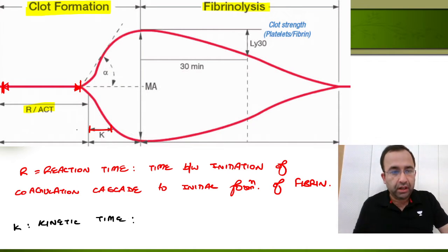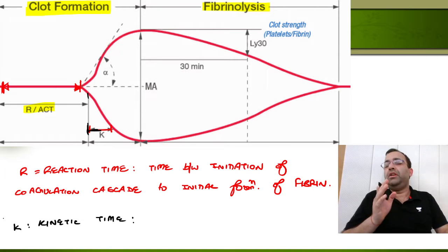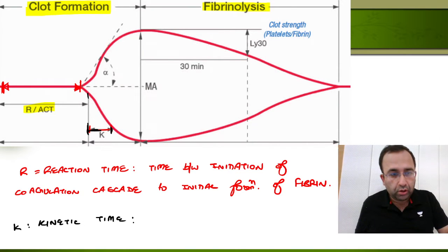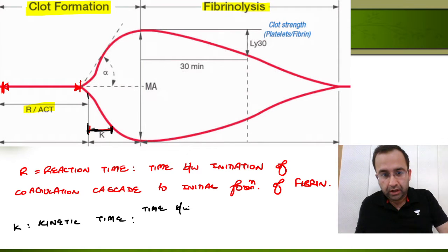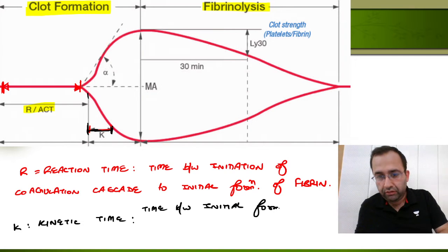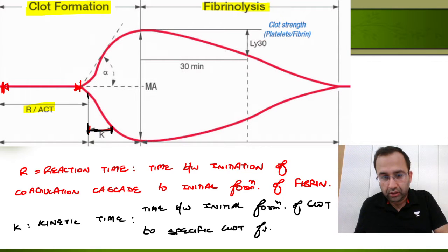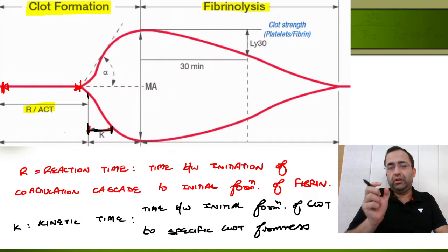That is the time between initial formation of clot, when clot formation has started, to specific clot firmness.